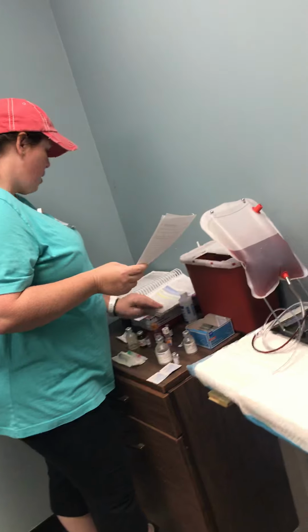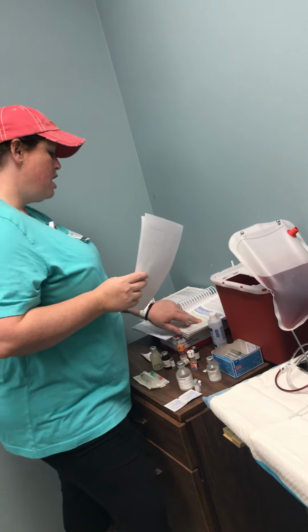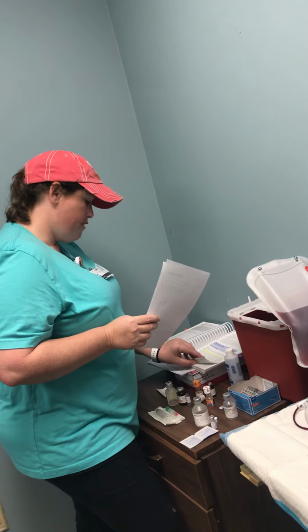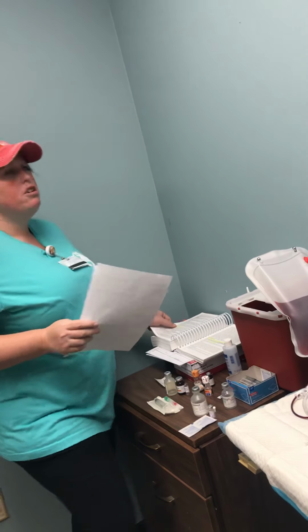I'm going to check the safe dose in the book, and it's 2 to 10 milligrams, so we're safe with that. And you can give it every 3 to 4 hours as necessary. You can give it undiluted, but since it's a small amount, we're going to dilute with normal saline and give 5 milliliters.